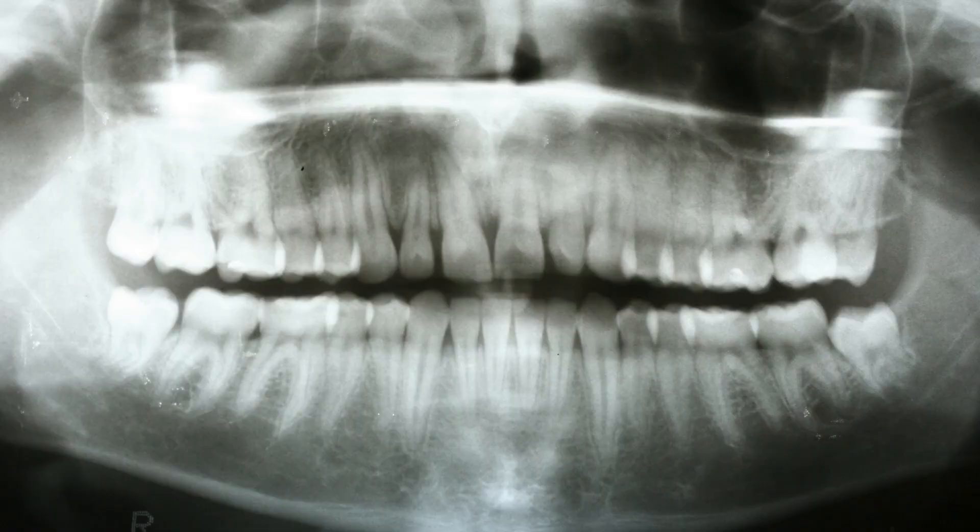So this patient is almost 17 years old. Their upper wisdom teeth are fully up, as you can see here, but they're kind of crooked. They're overlapping the teeth in front of them. They're actually out towards the cheek, and the patient's complaining he's getting food stuck around them, and they're just irritating his cheek from time to time.